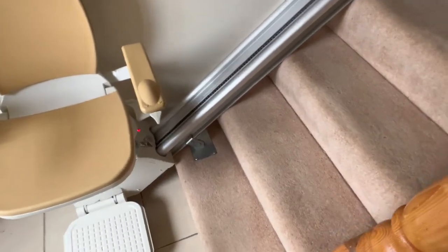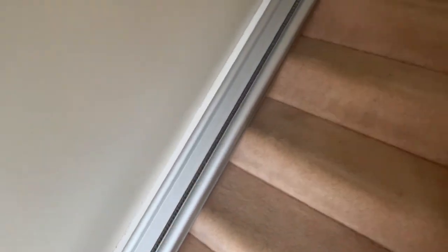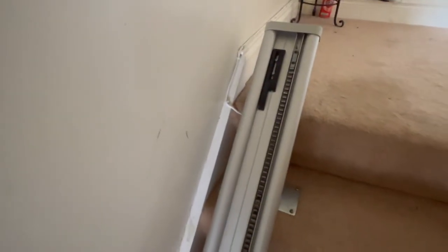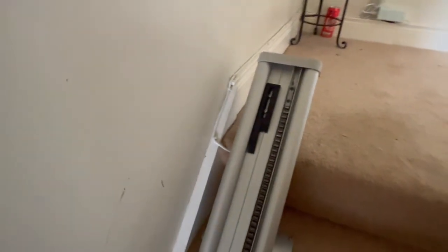Another thing to note about any stair lift is that they bolt down to the steps — as you'll see, there are bolts all the way up. They never attach to the walls. There's also a low voltage line coming in here, which means if something were to happen to that wire, no one is going to get hurt.